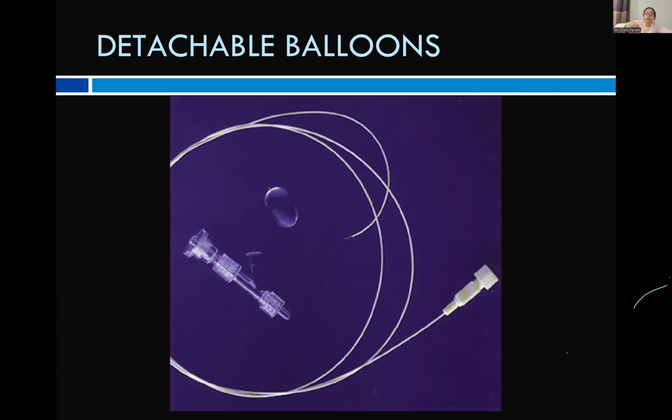Otherwise, if it's in a visceral location, then what you do is coil the neck of the aneurysm, both proximal and distal. You're going to go past the aneurysm in the normal vessel, start coiling the artery from distal to the neck of the aneurysm, across the neck and proximal, so as to trap both the distal and proximal ends of the vessel.